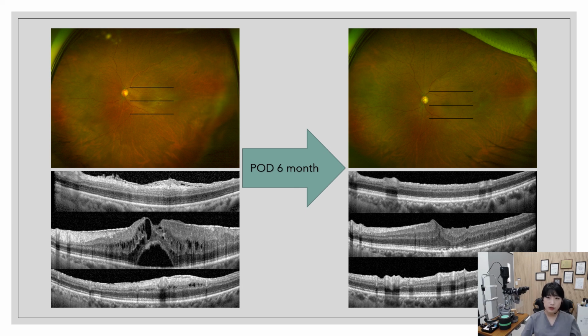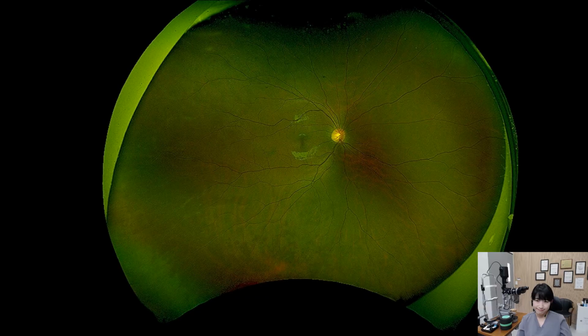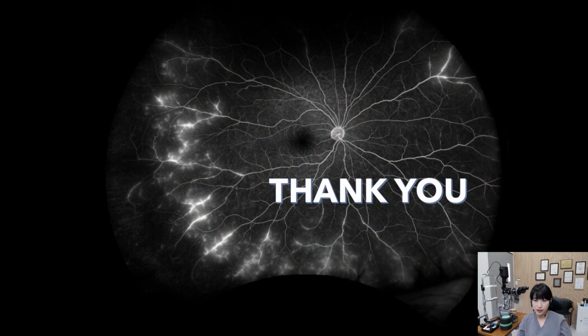Membrane peeling was successful, but it would have been better if she had taken the surgery earlier, in her ERM stage. The ultrawide-field OCT enables us to reach perfection, especially in the mysterious far peripheral retina. I expect that we could find a lot of new knowledge with ultrawide-field OCT.